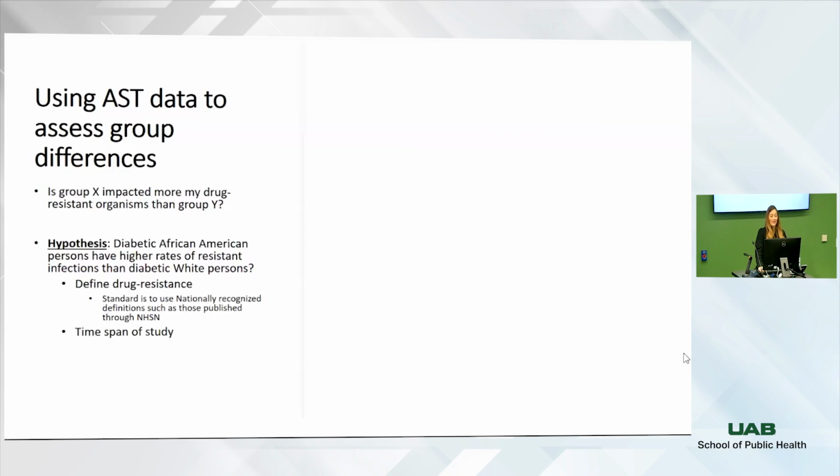All right, time span of the study. Who thinks that this is important for a study like this? What did we talk about with FDA and CLSI earlier? How often do these antimicrobial resistance definitions change, or do these breakpoints change? So yearly in some cases, if the data set you're working with is CLSI. So you want to make sure that you either have consistent breakpoints throughout the whole time, or that those breakpoints have been applied appropriately and consistently throughout the entire study span.